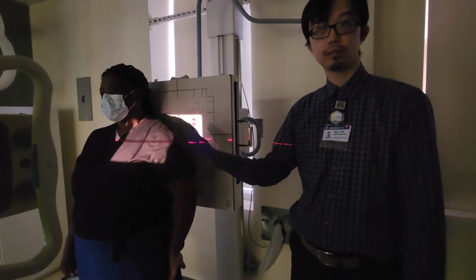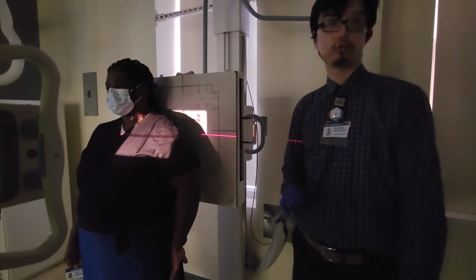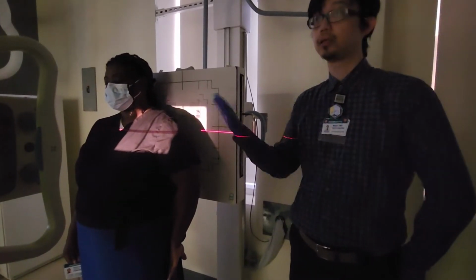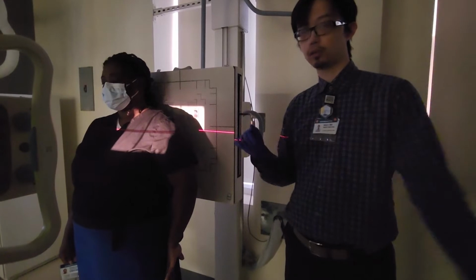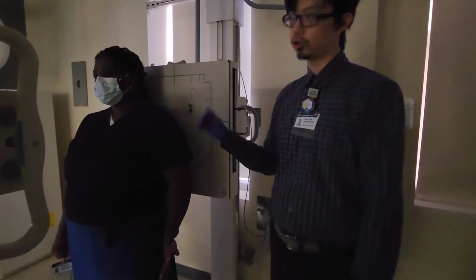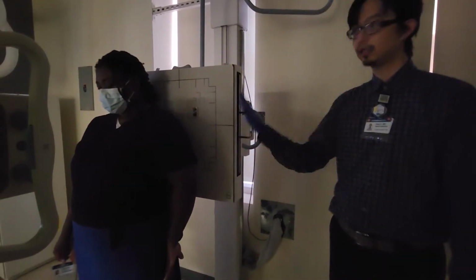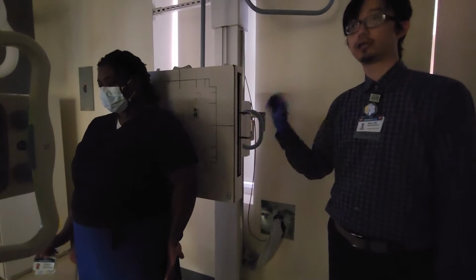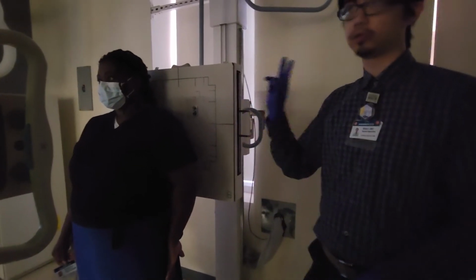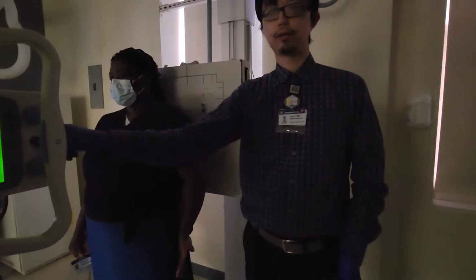Any change in our centering? No, right? Exact same location. So you don't need to move the patient at all. Just take the arm, spin it, and you've got your 2 shots, external, internal, external, internal. Okay, so hold your breath, X-ray, you can breathe. These are your routine shoulder X-rays. If you see an order for a shoulder, you're guaranteed to do these 2 pictures. Okay. Any questions so far?